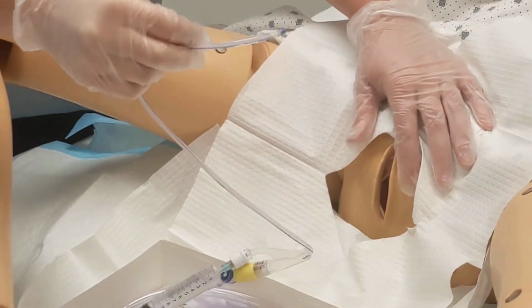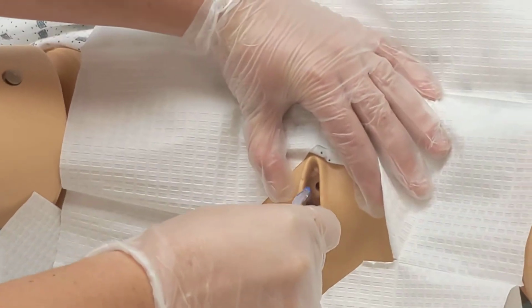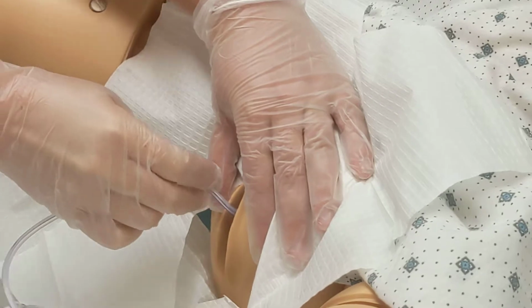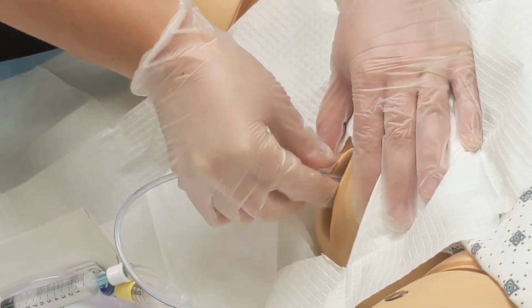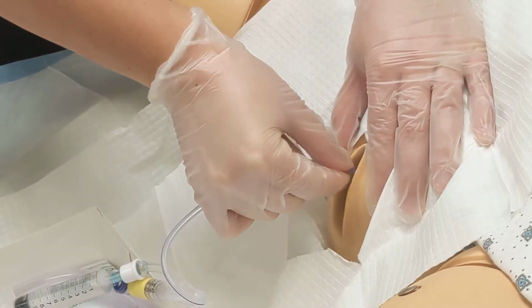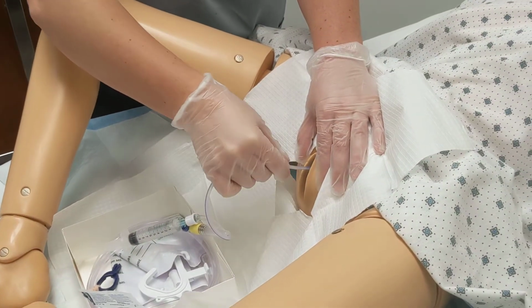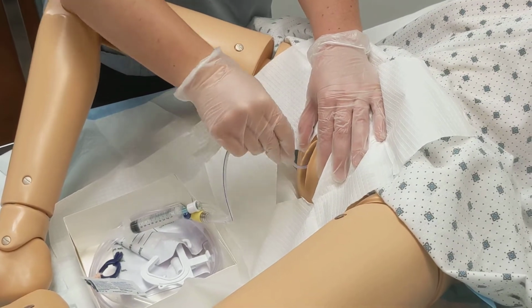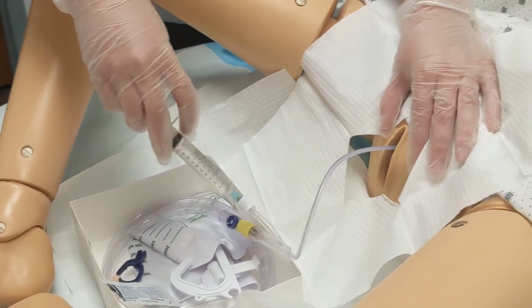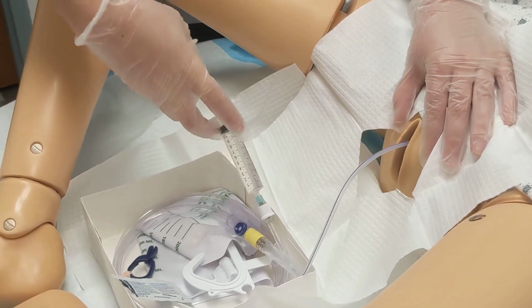And I'll just ask the patient to take a deep breath. And then we will insert. Okay, so I believe that we are now in. So now I'm going to fill our balloon up, and our package says 5 milliliters, so that's what we will do.